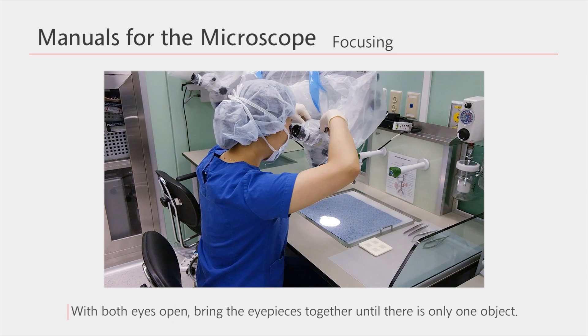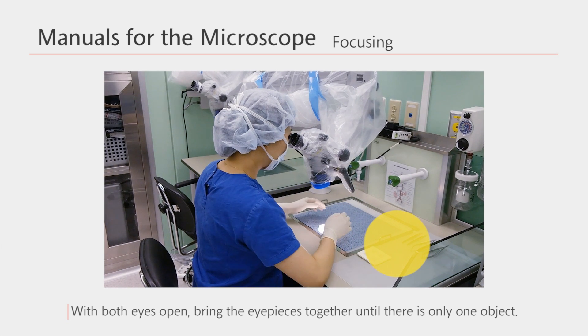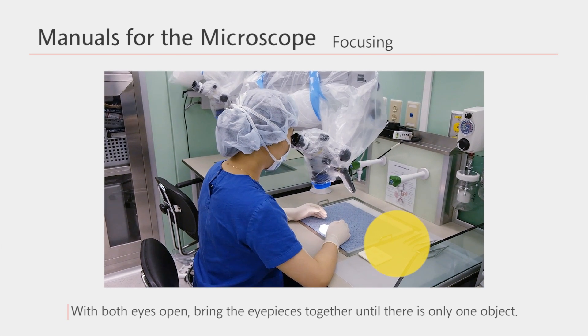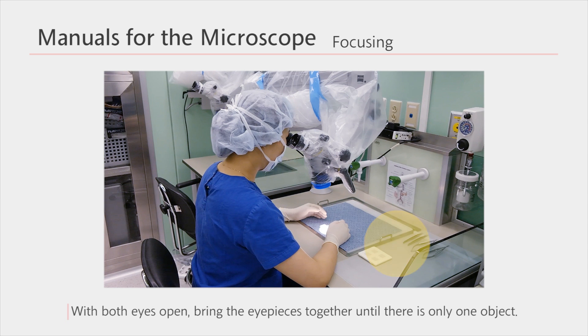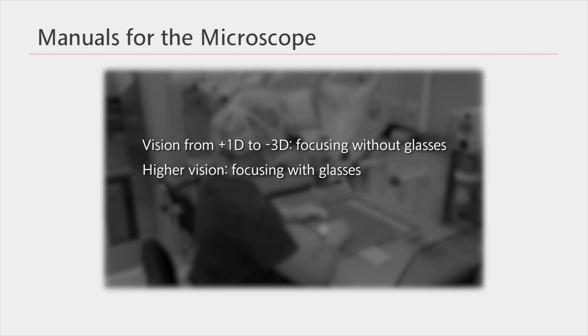Place the other eye on the eyepiece and finish focusing by adjusting the eyepiece. When you're done with focusing both eyes, open both eyes and bring the eyepieces together until the object is not blurry anymore. Near the coarse focus knob of the microscope, you can find the fine focus knob. During the microscopy training, you can adjust the fine focus with this knob. If your vision is from plus 1D to negative 3D, it is better to adjust the focus without glasses. If it's higher, it's better to do so with glasses.